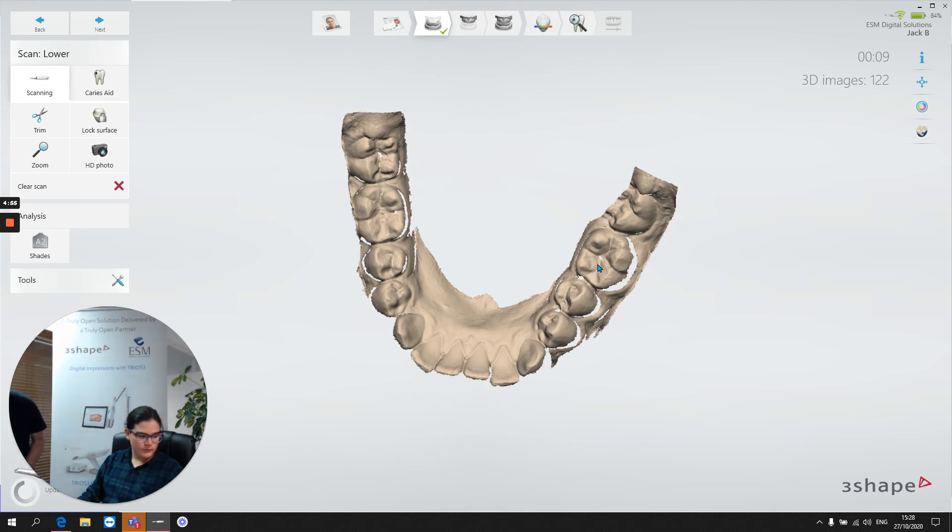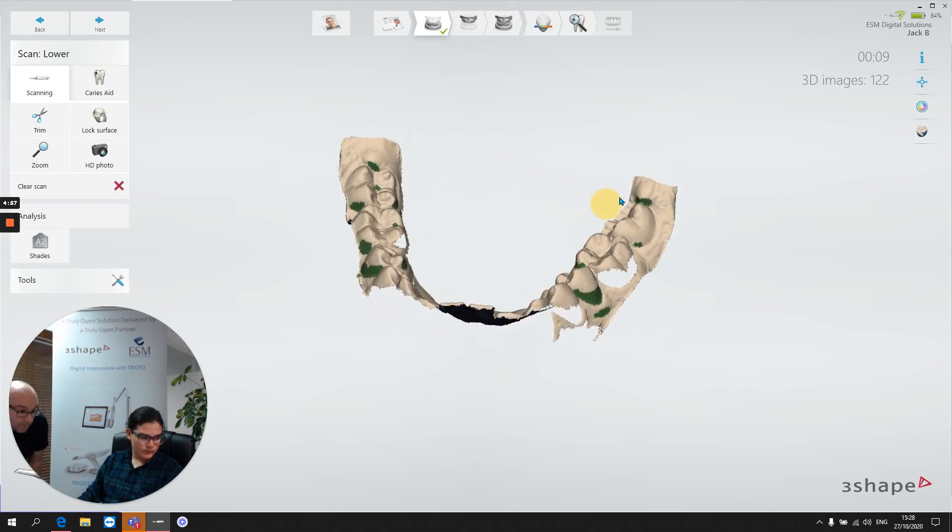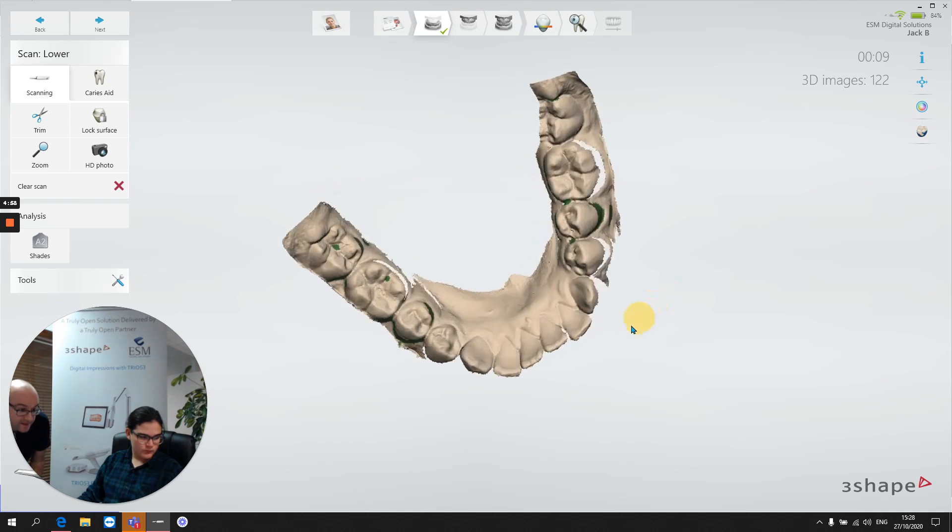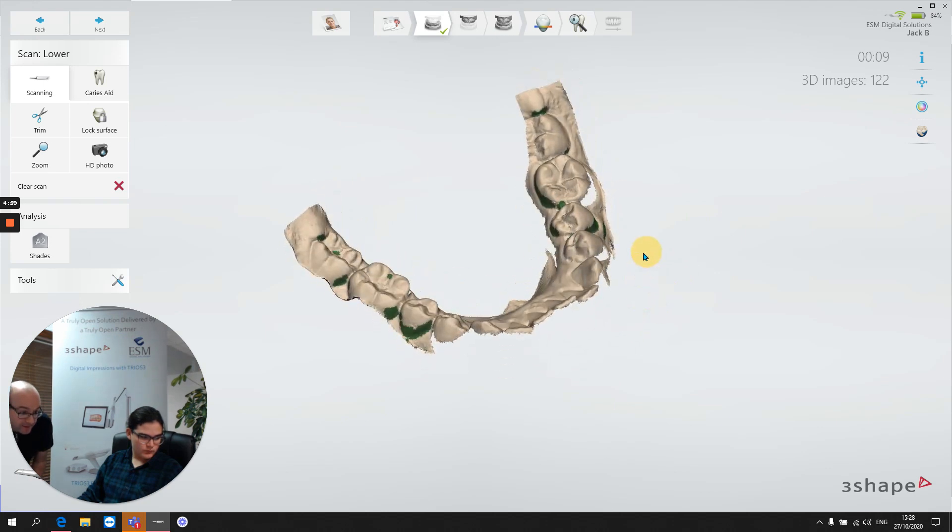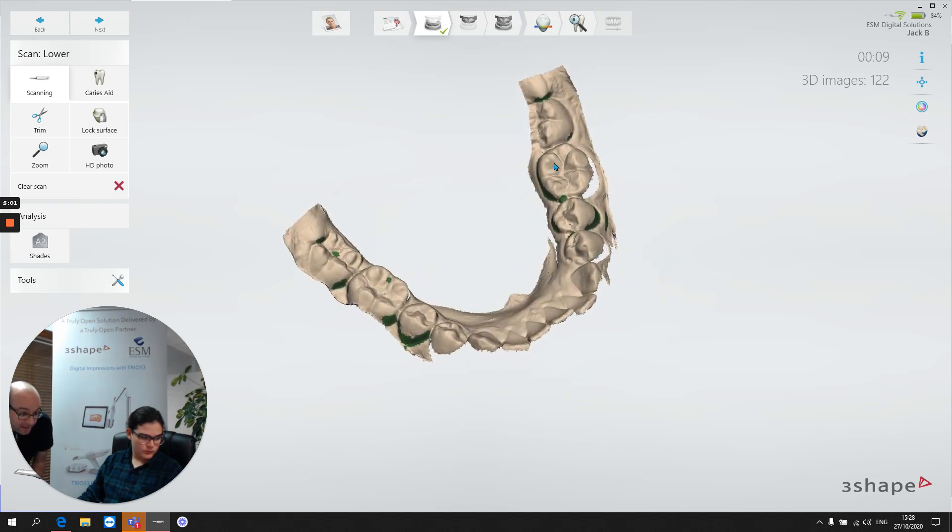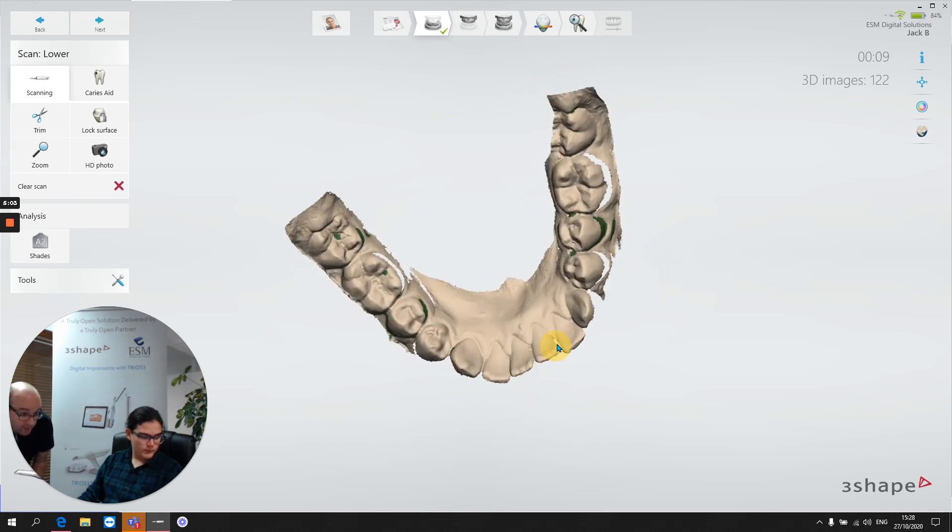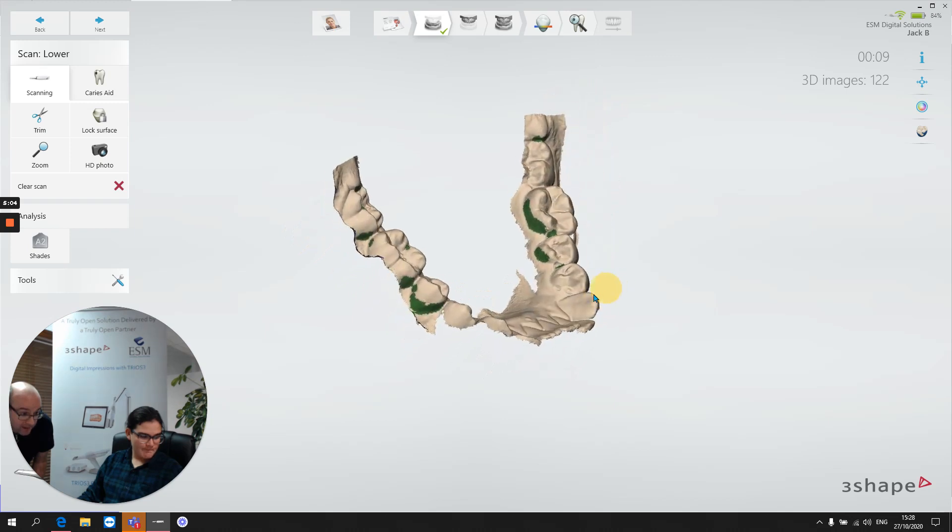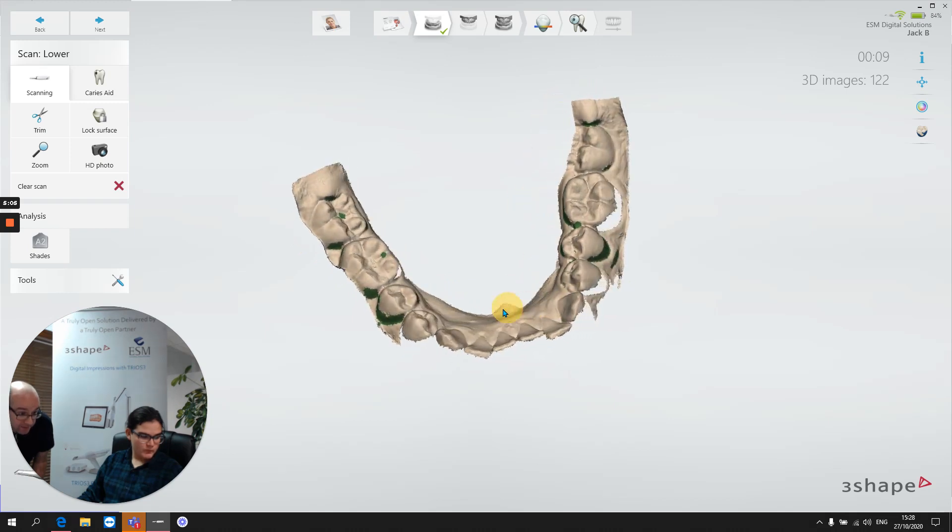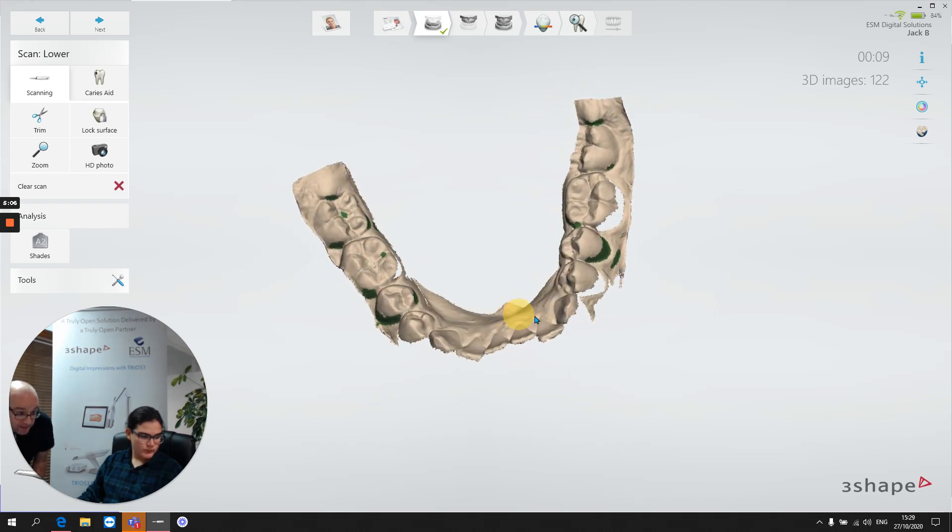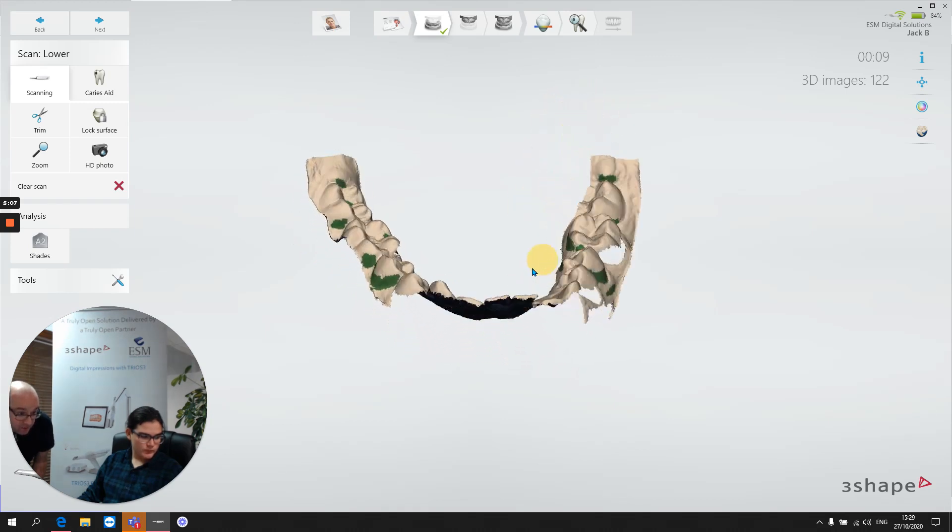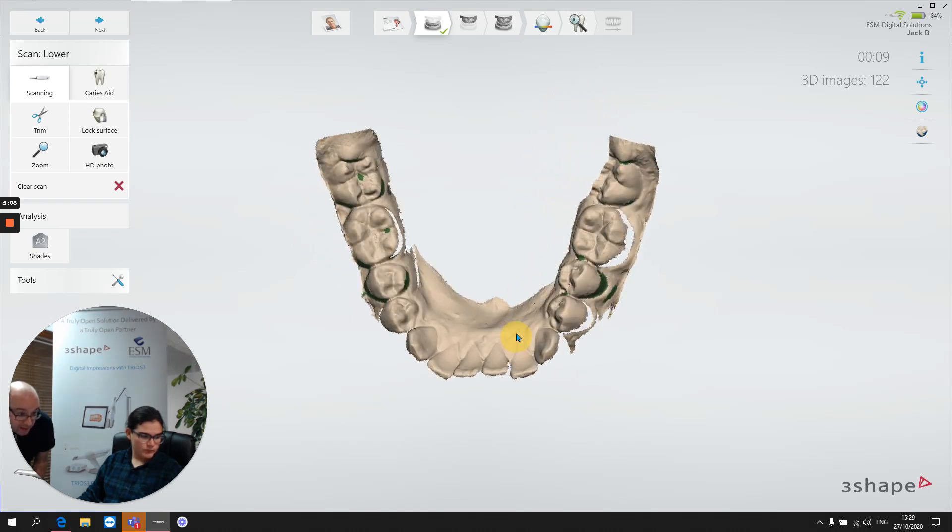Okay, so we got the color off there. This is a typical occlusal scan. You can see, again, we've captured all the occlusal detail. And on the posterior region, we've captured a nice level of lingual detail and of buccal detail as well.